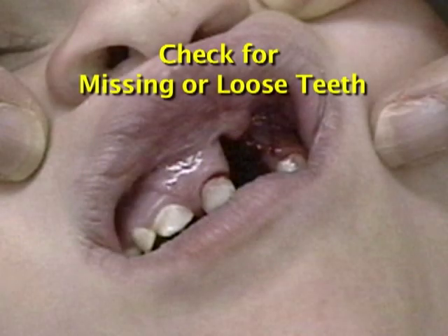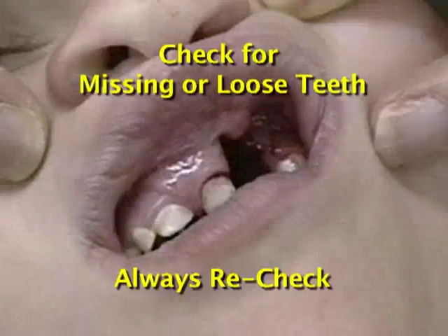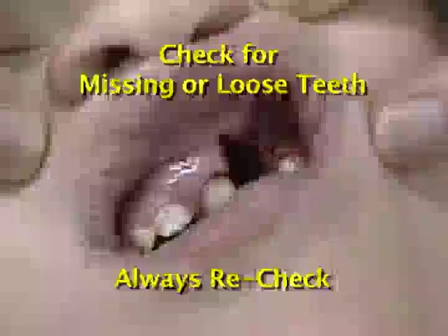Children often have loose teeth. If you have the time, check for loose or missing teeth before you start. Always recheck the teeth after you've placed an oral airway or intubated. If a tooth is newly missing and you can't find it, get a chest X-ray.